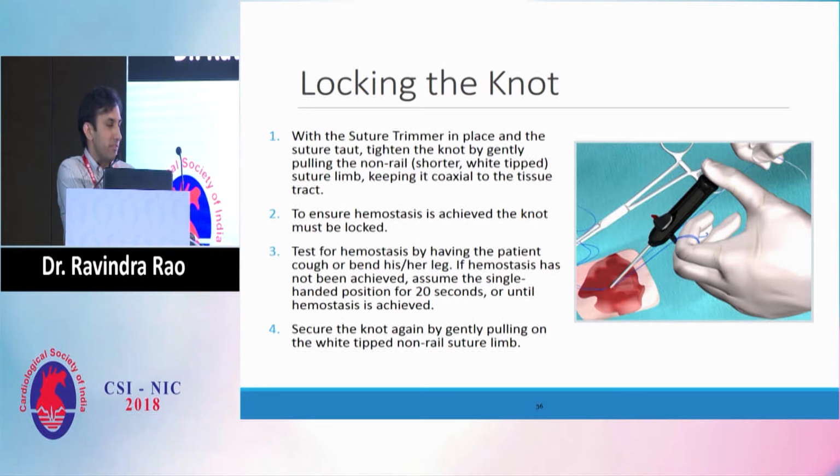So now, everybody here and in the audience, most of you, if you are doing a PCI and if you have a common femoral artery puncture, again, very important to do a femoral angiogram before we go ahead and deploy the ProGlides, because you want to be sure that the entry point is in the common femoral artery. If the puncture is correct, if the site is correct, then most likely you will have a good closure.